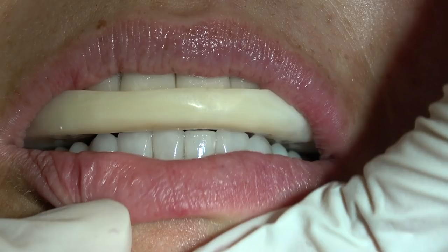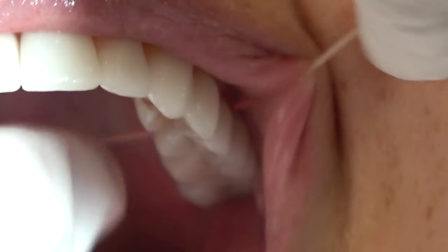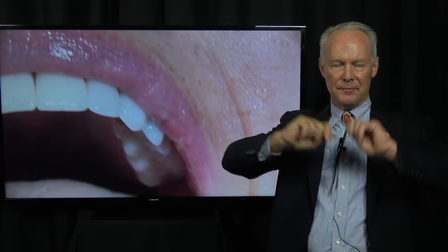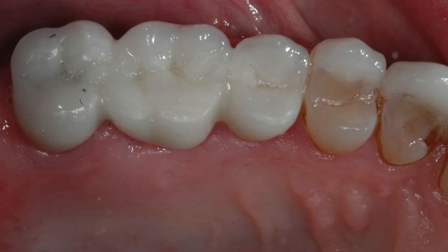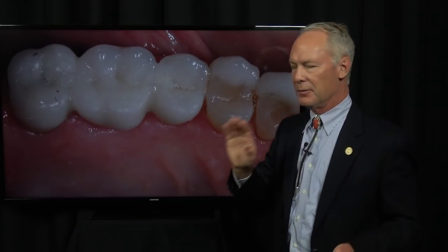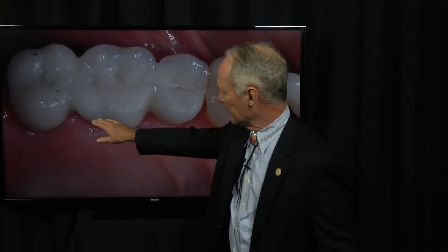You can refer to the Dentistry Master Classes video on occlusion for why we do that, and here's a link to how to make a night guard — also in the Dentistry Master Classes library. You want to teach the patient how to floss under the bridge with superfloss. Find an area for the monofilament line part of the superfloss to go under the bridge in the interproximal area, then pull it through. The superfloss will feel snug as you move it under the pontic because you had blanching when you placed it. Make that area flat on the palatal side so the patient doesn't pack food.